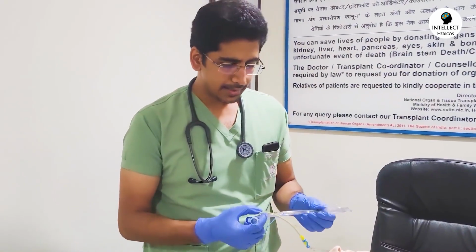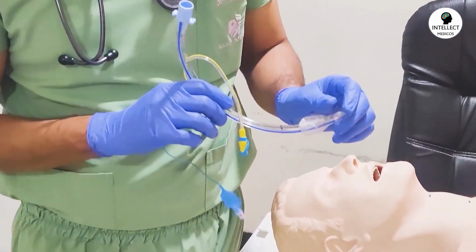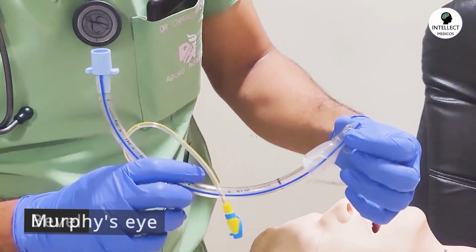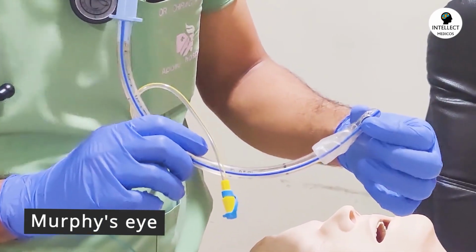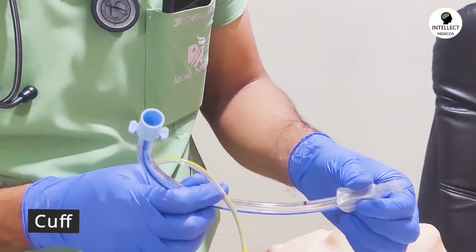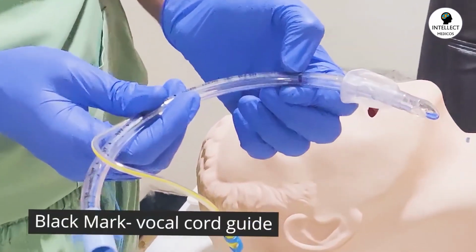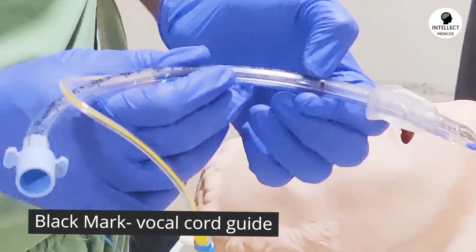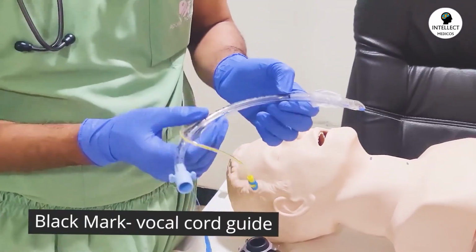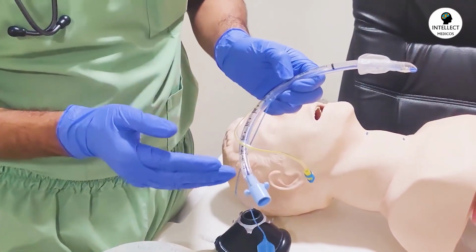Now the parts of this endotracheal tube, starting from here: this is the bevel having a Murphy's eye so as to act as an adventitious port. This is the cuff of the endotracheal tube. Then there is a mark over here. This black mark should ideally cross the vocal cord while you are intubating a patient. And there are various marks over here so as to see the depth.